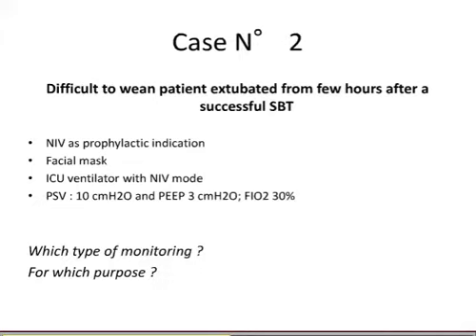Here, we suppose that the patient is okay because we decided to extubate, but then the risks are poor tolerance and secretions, so it's maybe less looking at the ventilatory parameters and more looking at the clinical situation of the patient and secretions. And unfortunately, we don't have monitoring tools for secretions. For non-intubated patients, there is something now for the intubated patient, which is just a sound.